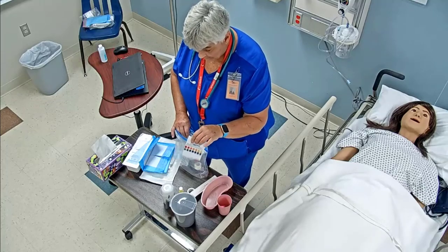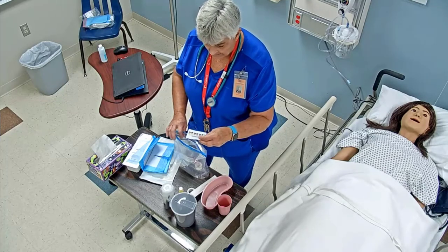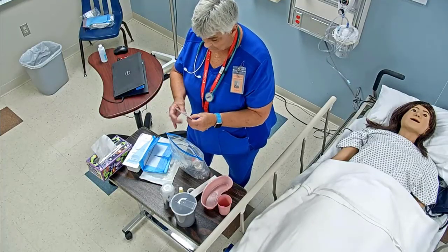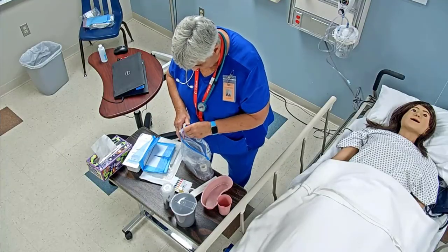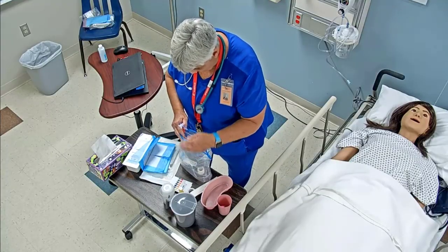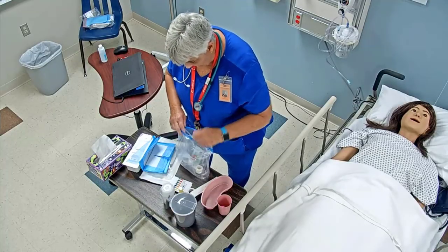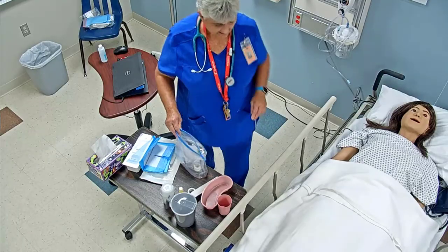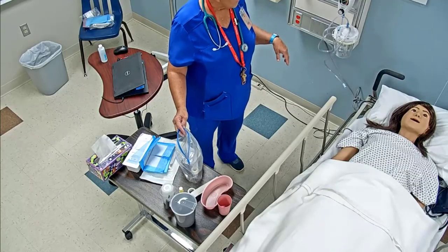I've also got my pH piece of paper, and it starts in increments of 0.5, and this is for human, so we want to make sure it's for human gastric content. I have my Lopez valve, and I've got my test strip, because we want it to be 5.5 or less when we get in there. I would also need to know if I had suction tubing. We would want the extra long.